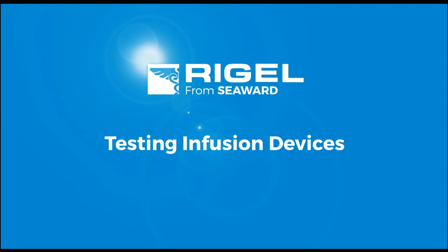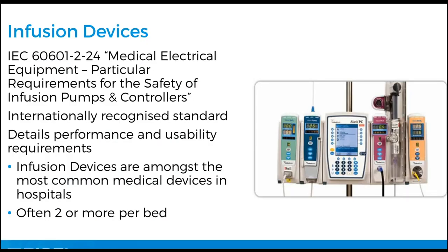Testing these infusion devices. The standard pretty much lays out the design criteria, which is 60601-2-24. And just like the whole series of 60601, it is for the particular requirements for safety. It's an internationally recognized standard. How an infusion device performs comes back to some of the characteristics in the standard and how it performs.